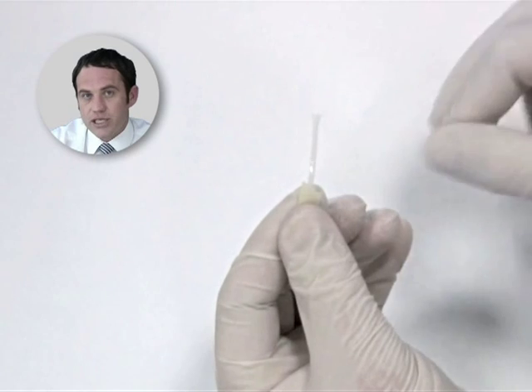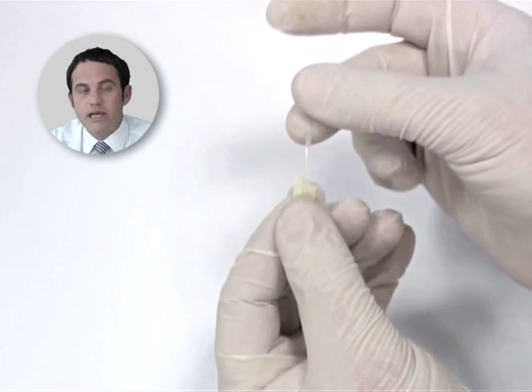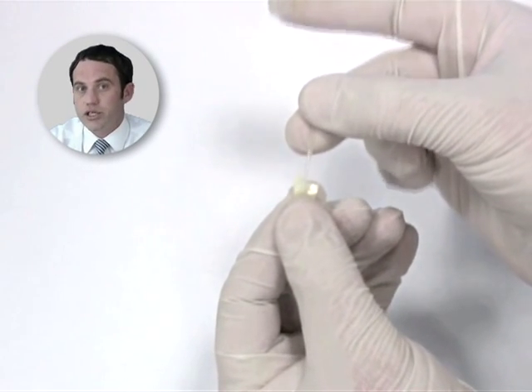Dentipreg strips are slightly tacky and made of aerospace grade glass fibers, pre-impregnated with light curing resin. They are soft and pliable when uncured, and hard and rigid when cured.